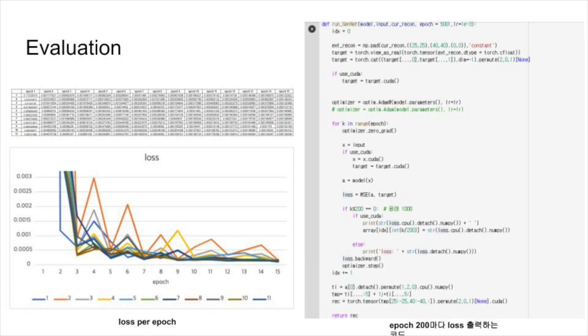In one epoch, GenNet is repeated 2001 times, and the loss value is printed out every 200 times. We can investigate the trend of change in loss value within one epoch. Through this, we can learn that there is oscillation of the loss value, but it can be seen as the loss gradually decreases as the epoch progresses.